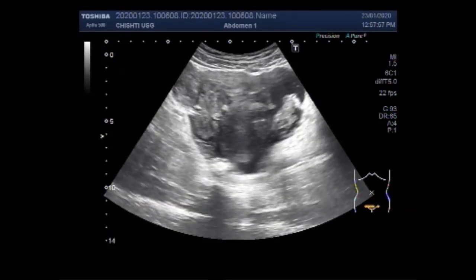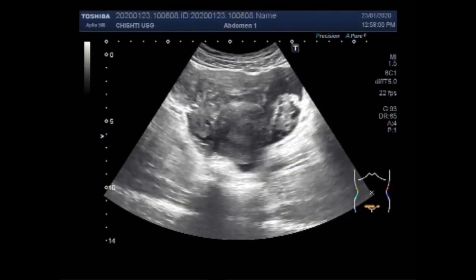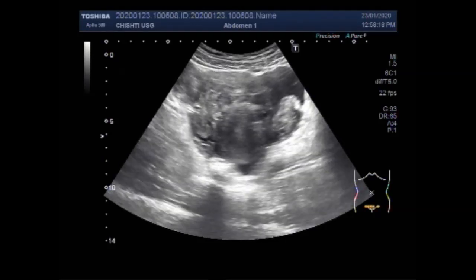Now you are going to see both ovaries. This is the right ovary and this one is the left ovary. You can clearly see the difference — the free fluid is seen predominantly around the right ovary.